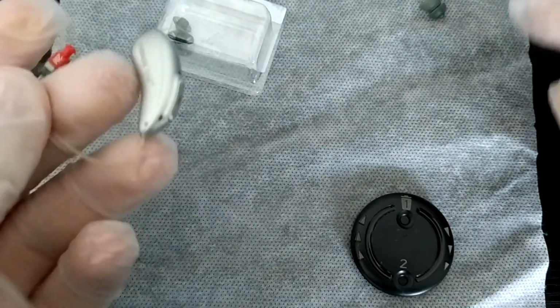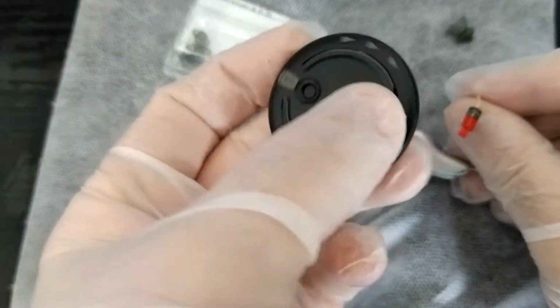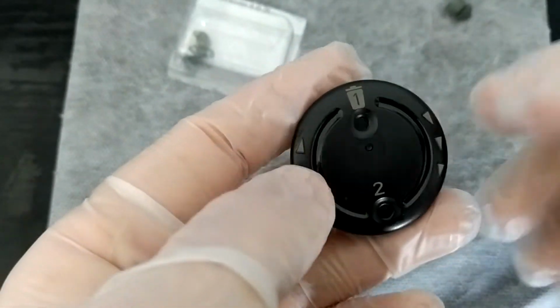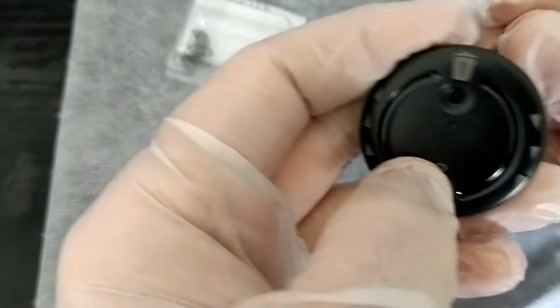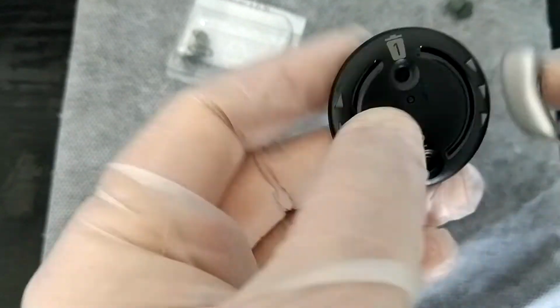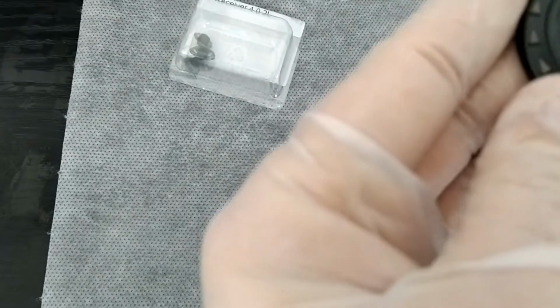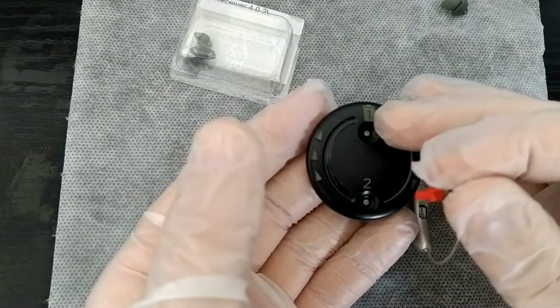Then you want to have a look at your device, which is there. Okay, and you want to turn it after you've placed your receiver into the hole, which is there. So that's how you remove it. You place it in there, remove that. So that's the old one now removed.